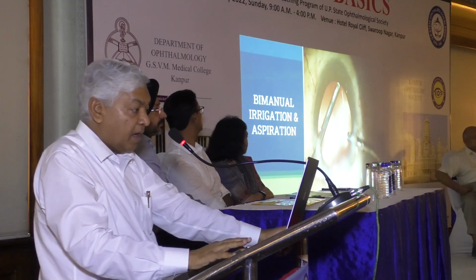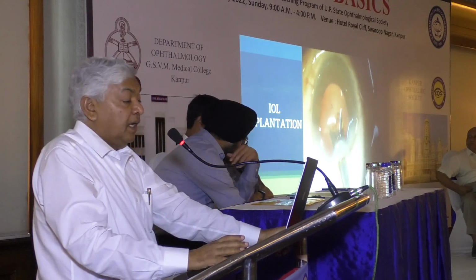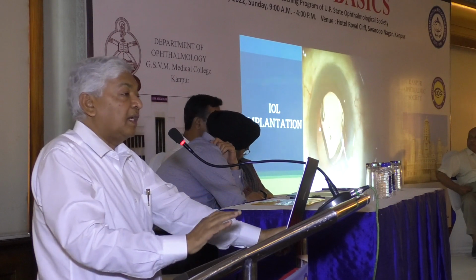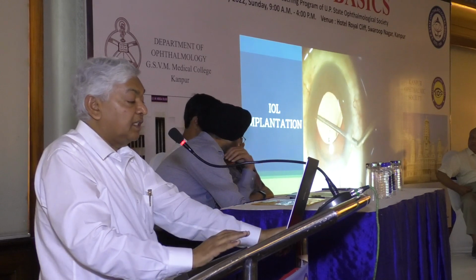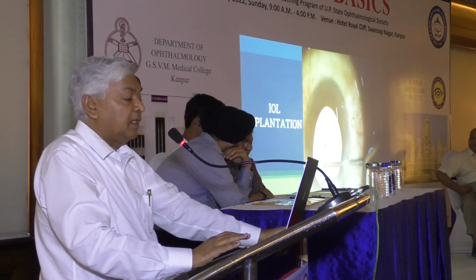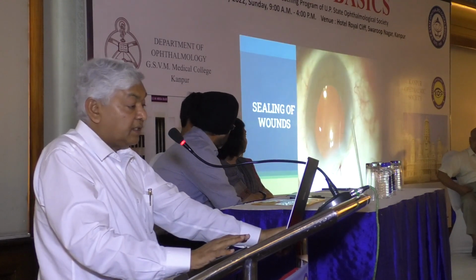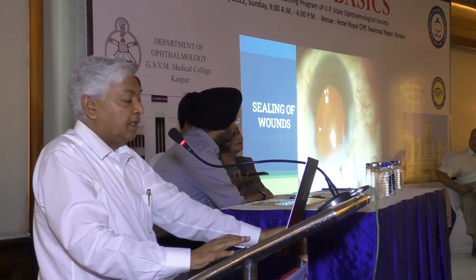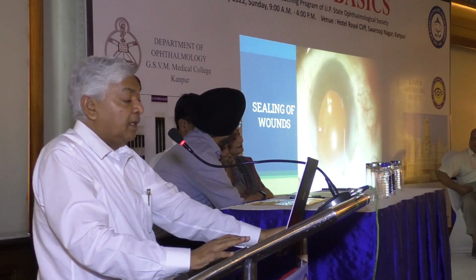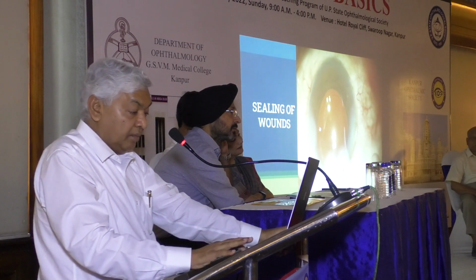The margin should be washed properly, and then again the IOL implantation. Do the basic trick again. Just inject it, and it should be directed so that at least the leading haptic goes in the bag. Once you are back at the junction, just rotate it, and very easily, without damaging the capsule, you can implant very well. Now this is also an important part: seal the wound with hydration of the wound. It should be watertight.